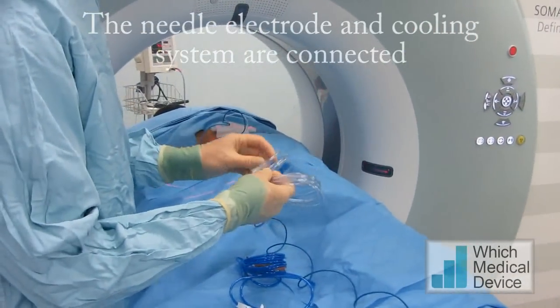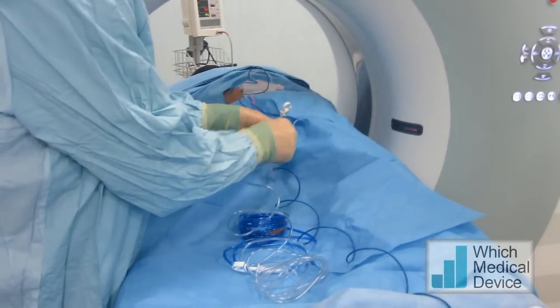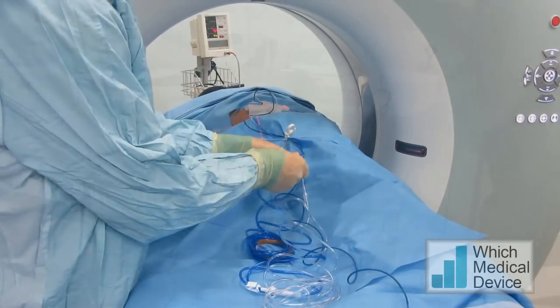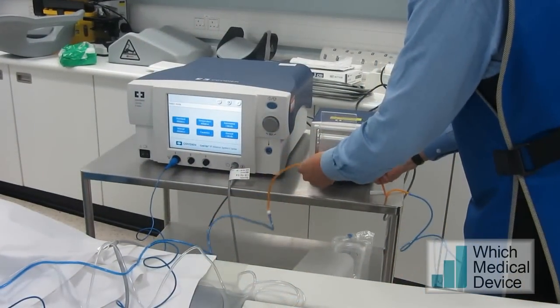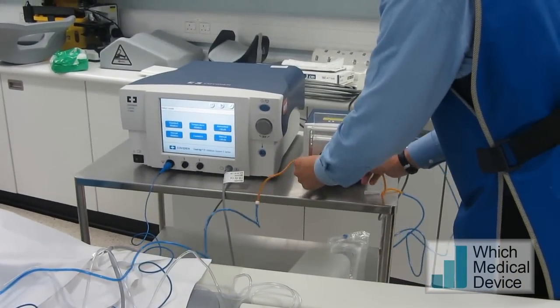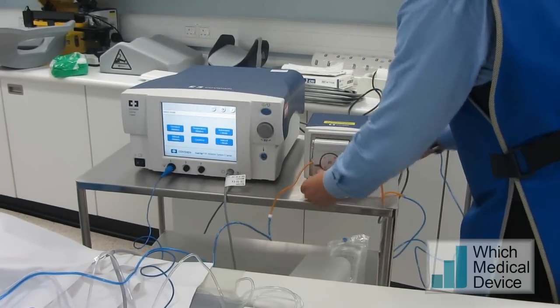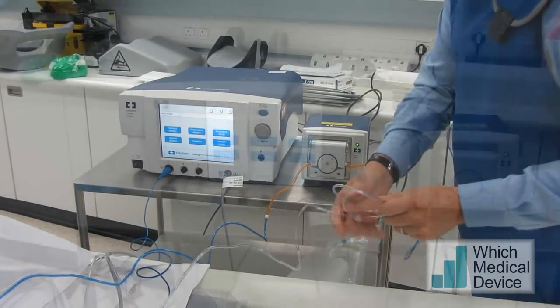These are the connection tubings for the irrigation to keep the tip of the needle cool. It's a closed circuit, so this doesn't actually come into contact with the patient. That's the tubing being put through the pump, connected to a cold bag of saline.